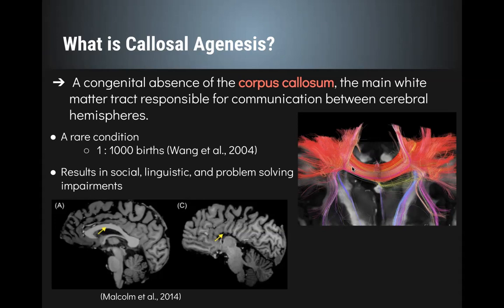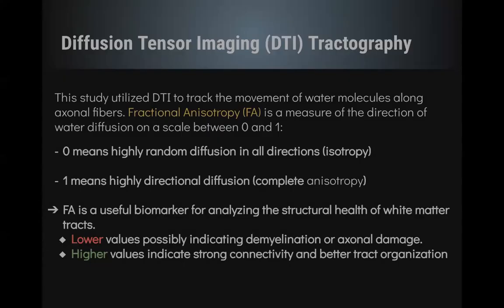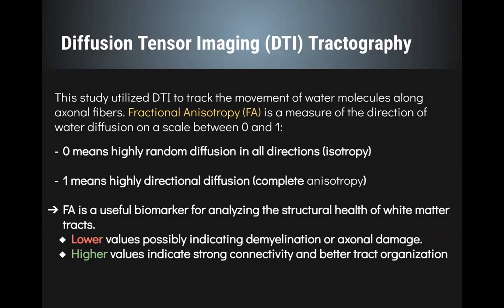and then in the figure at the bottom you see a really cool image of agenesis. So it's pretty noticeable in the MRI images. So this study, I'm trying to make it so you can see.